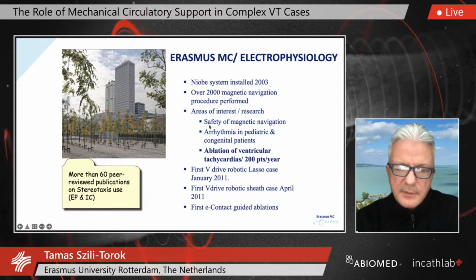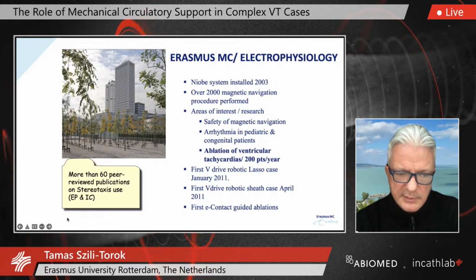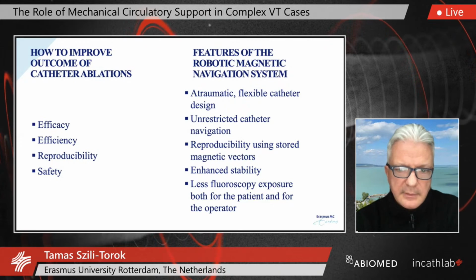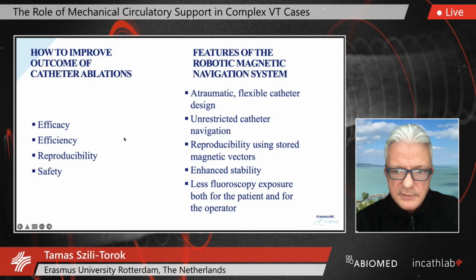And we also have areas of interest in terms of research. And here you can see that one of them is the ablation of ventricular tachycardia. So we collected data continuously during those years, and we were actually convinced ourselves that this is the way to go, at least for us. Now, when I put it a little bit in a broader perspective, we all work continuously since decades to improve catheter ablations, and obviously in VT ablations we can improve efficacy to a certain extent.